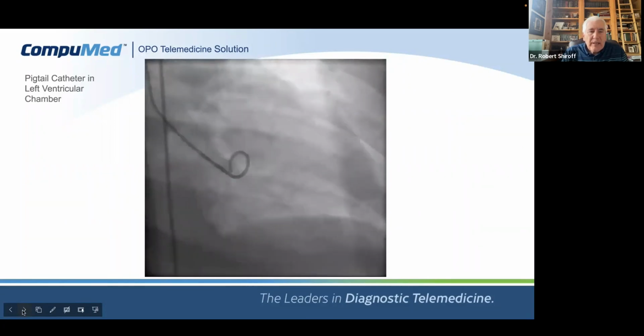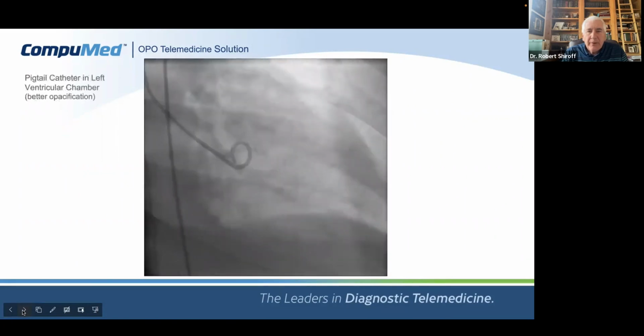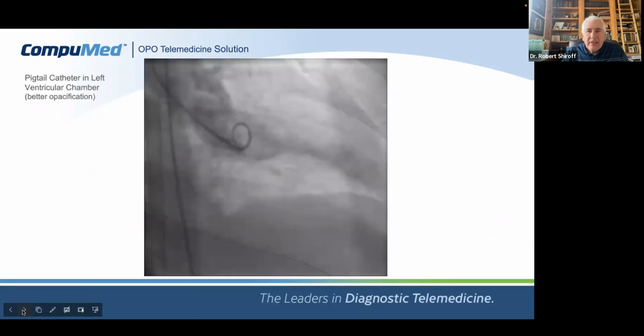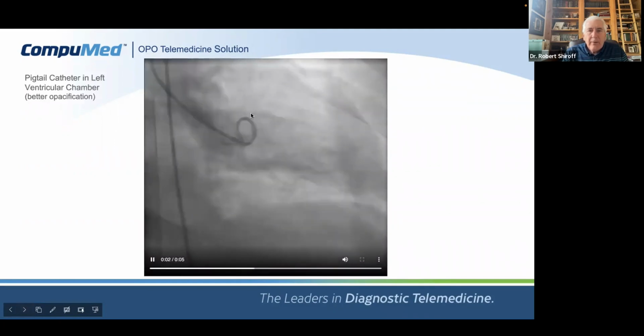He did it twice more. The second one was just like the first one. I didn't bother showing that one. Here's the third one where he gets a little better, and you can actually see the chamber there. The chamber is right here, coming around here.